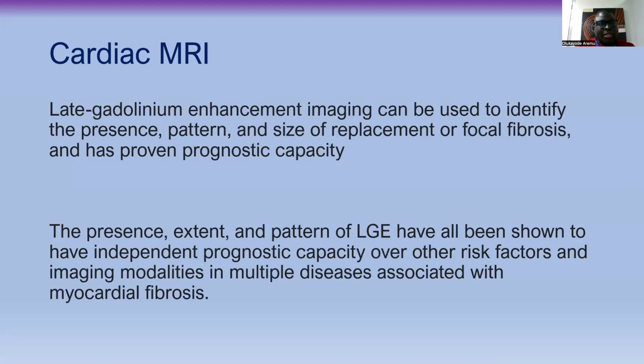Okay, so let's talk about gadolinium enhancement imaging. I have mentioned the word enhancement, and I've explained why it gives a bright signal. That is the term enhancement. That is what it means.